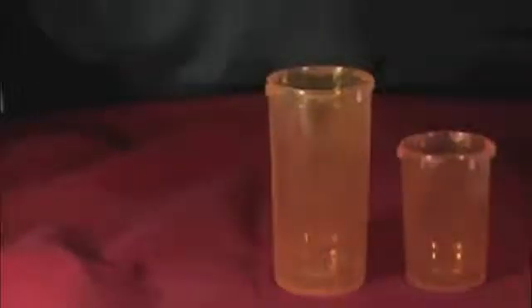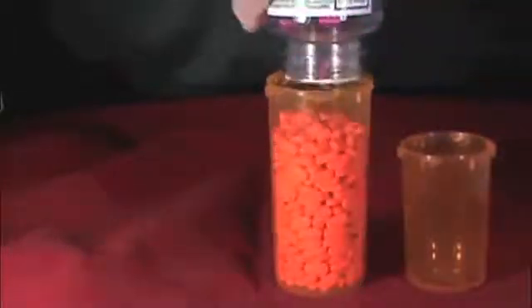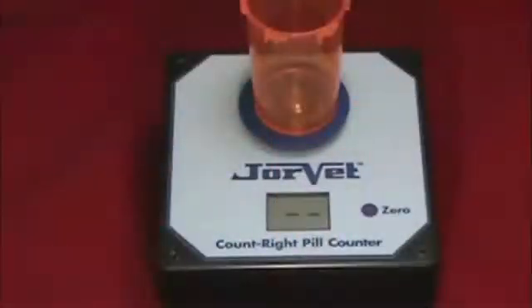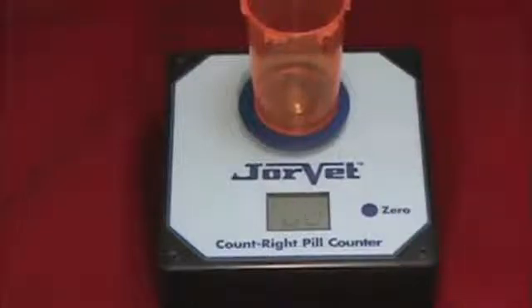Start by pouring the pills to be counted into your large container. Place the dispensing pill vial on the platform and press the zero button. The display will show a pattern of rolling balls followed by a steady zero as the counter determines the weight of the empty vial.